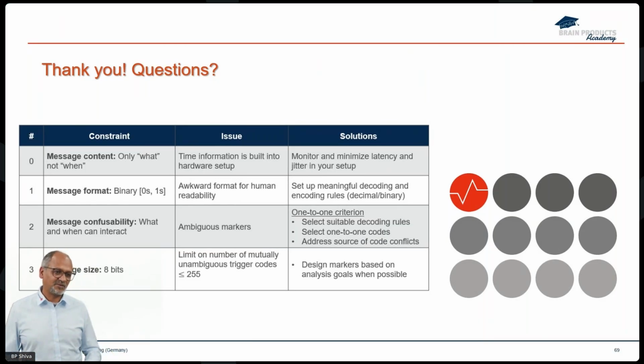So to put it briefly, it's very important to send triggers for both correct and incorrect trials, and to sort this out later during analysis. During acquisition, you want to make sure all context information, to the extent relevant, is captured, including errors, which are reasonably relevant, even if not directly.